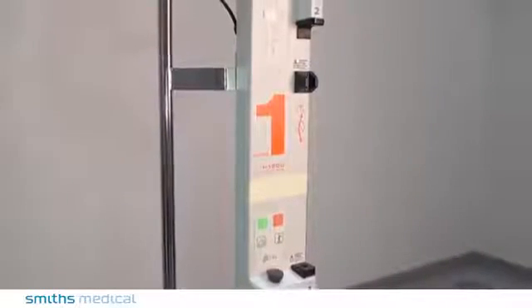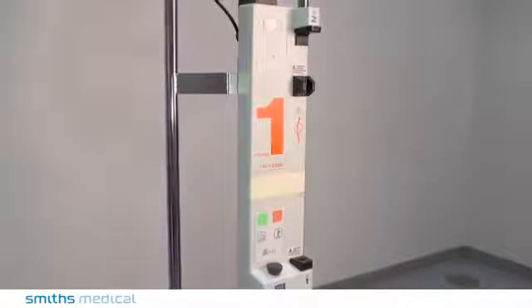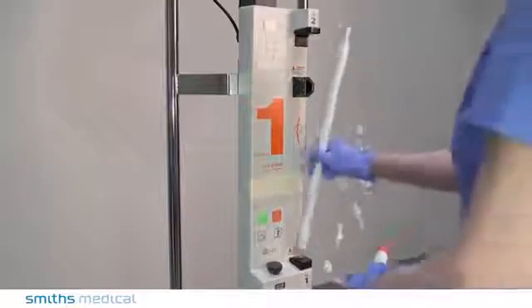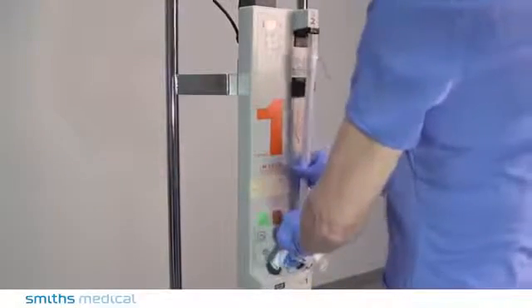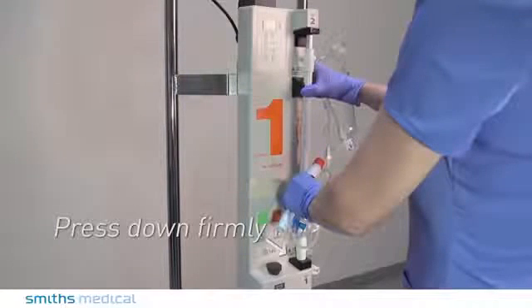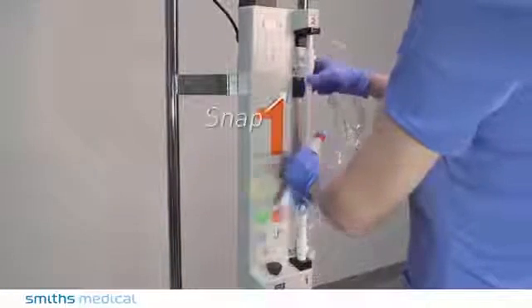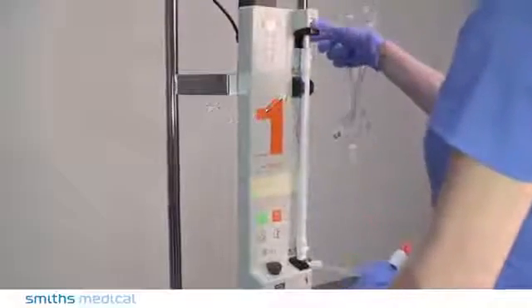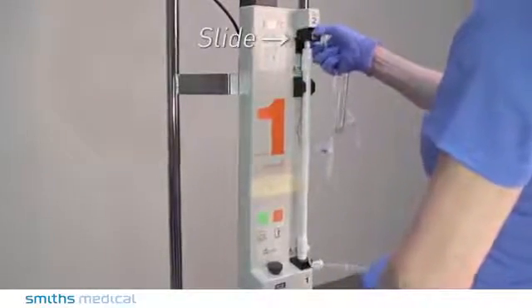To install the Level 1 IV Administration Set onto a Level 1 Fluid Warmer, start by inserting the bottom end of the heat exchanger into the number 1 block. Press down firmly to properly seat the heat exchanger. Snap the heat exchanger into the guide. Slide the number 2 block down firmly to secure.